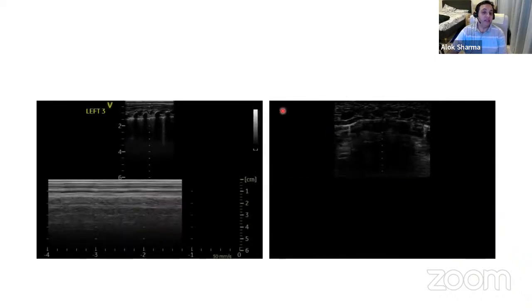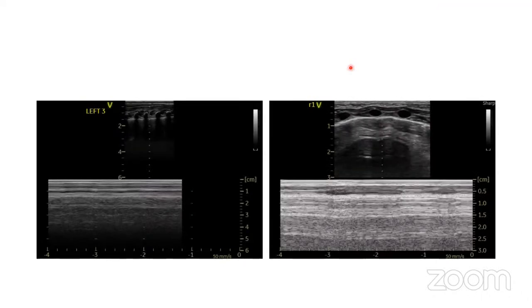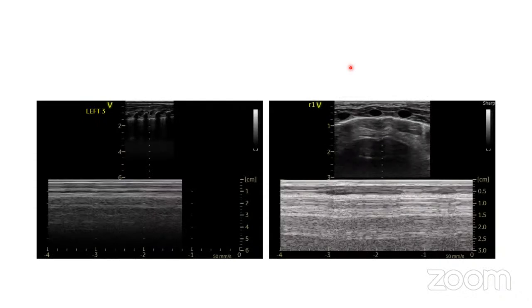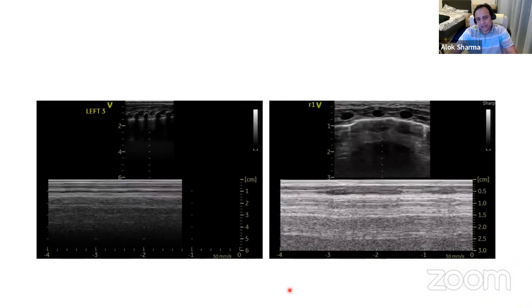So these are the images side by side now. Can you see the difference? Yes. Can you see why I'm making a diagnosis of a right anterior pneumothorax? Yes. This is a classical seashore sign. But actually, what you've got is a lung point here with a barcode appearing. This is the seashore sign, and then you have a barcode appearing over here. Can you see the difference? Yes. And that's how subtle it can be.